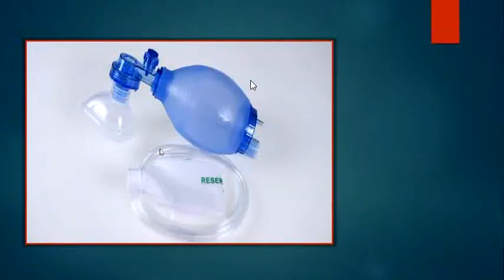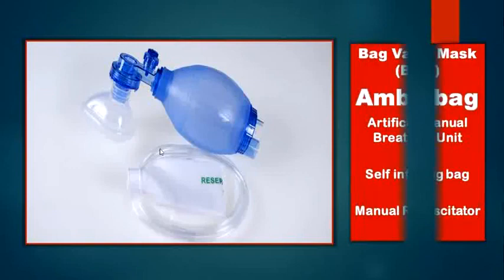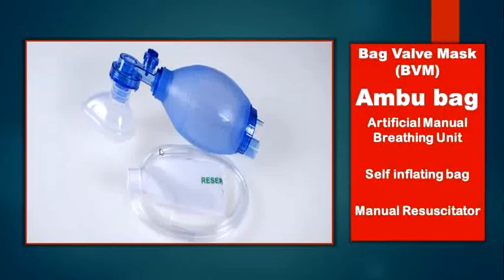Now we will go to another instrument, which is commonly used in neonatology and even in pediatrics and medicine in general, because this is life-saving, which is called the ambu bag. What is the abbreviation of ambu bag? Ambu bag stands for artificial manual breathing unit. The scientific name for this instrument is bag, valve, and mask. So they call it BVM.